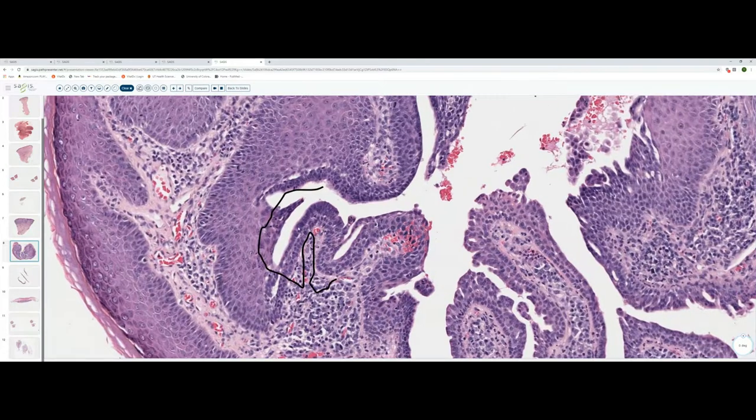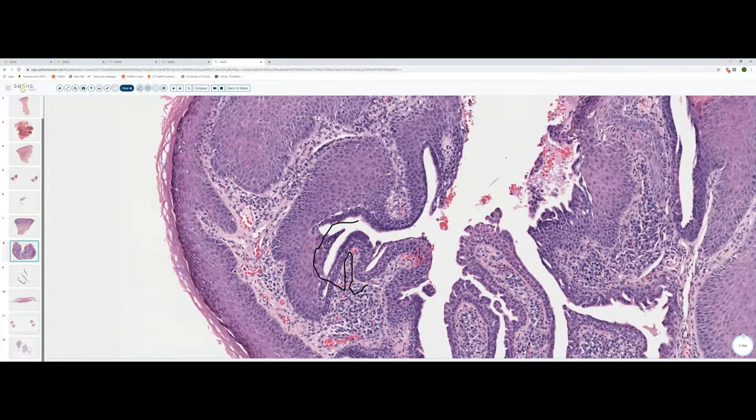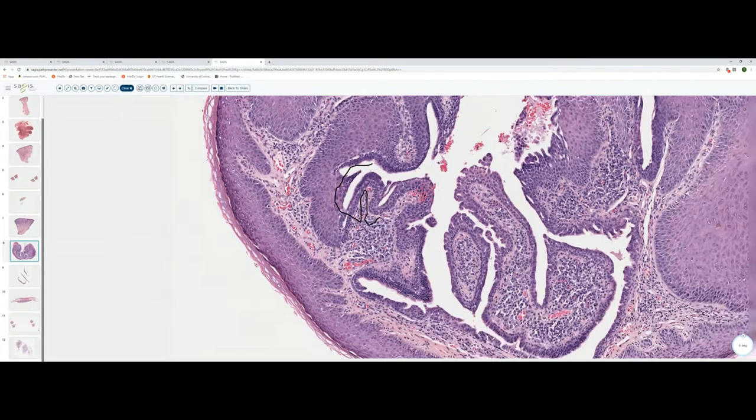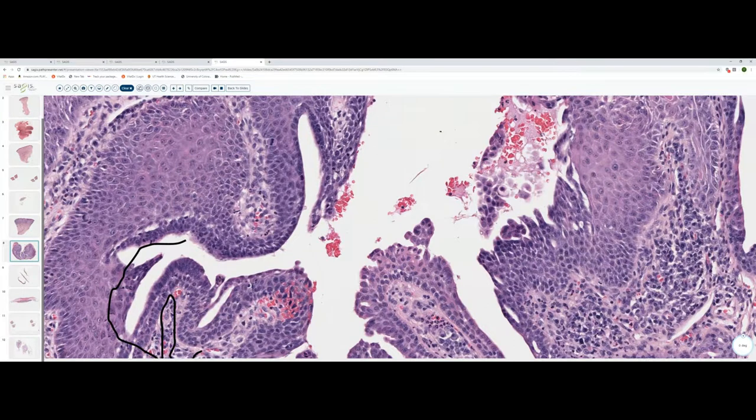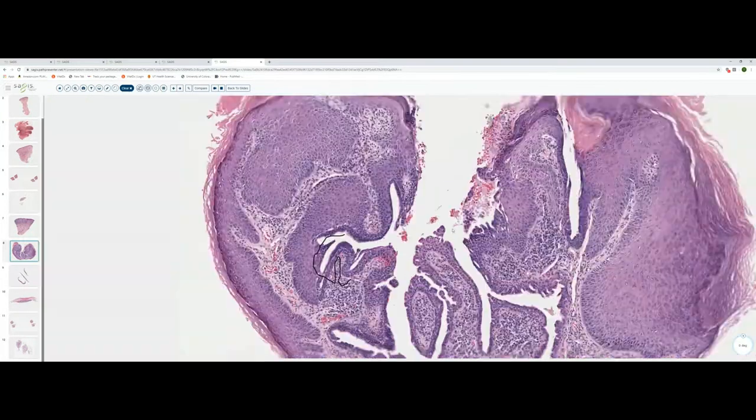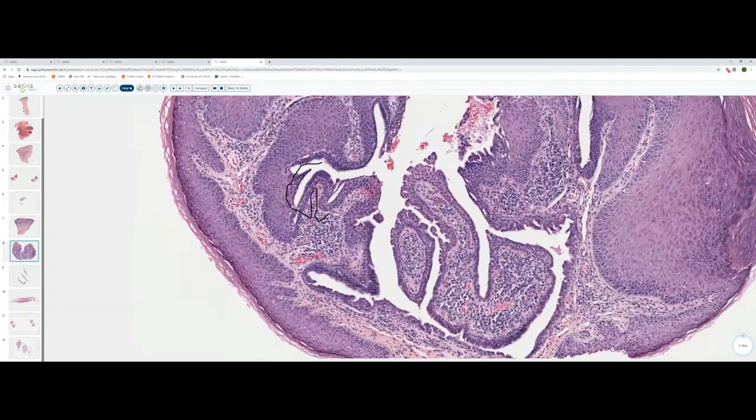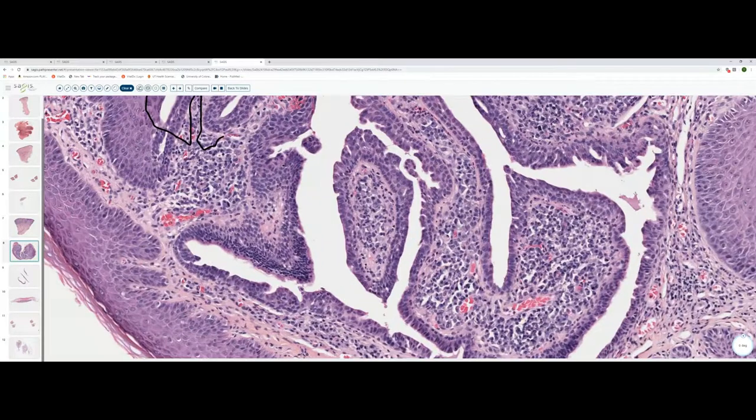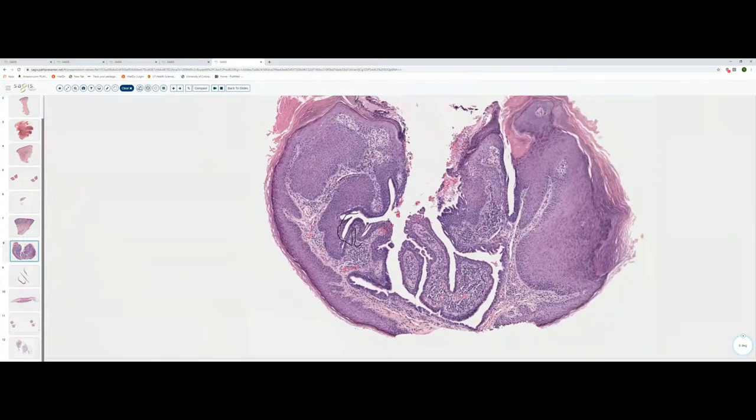Furthermore, the neoplasm is forming these elongated tubular structures that extend down into the dermis. There is some evidence of decapitation secretion. So this is clearly showing apocrine differentiation with the decapitation secretion and the elongated branching tubules. And then of course the key to the correct diagnosis rests in the recognition of plasma cells here within the stroma of these papillary projections. And this is a syringocystadenoma papilliferum.